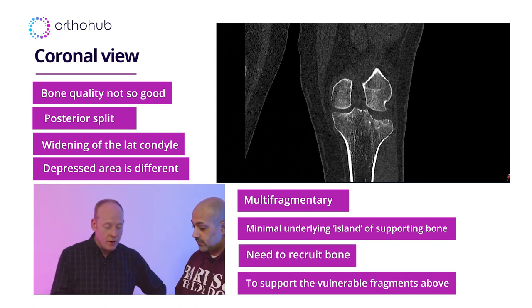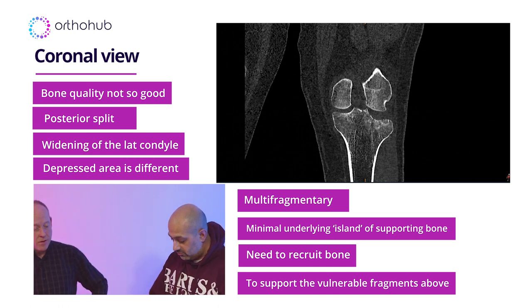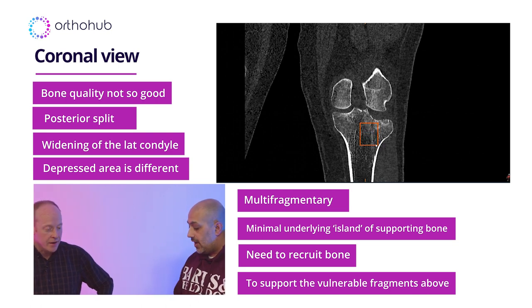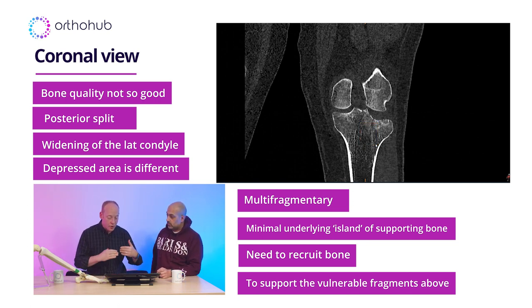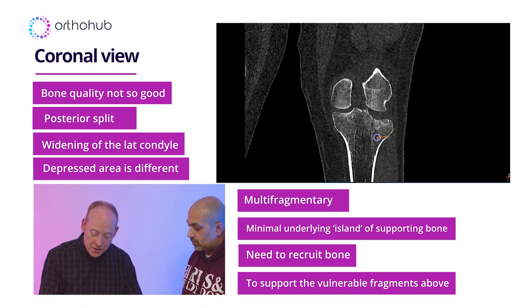And where would you recruit bone from? Where do you get it from? So recruiting bone is a challenge, but you want to take some with that. So realistically, you would probably try and recruit something from further down here. Absolutely, yeah, and totally agree. And bring that back up. Accepting, then, you may leave a void there that you may need to fill if you can't support it and hold it. That's it, yeah. So some kind of starting with an osteotome or punch or whatever it is, but starting right down here, maybe even right down here, and bringing that bone up underneath.